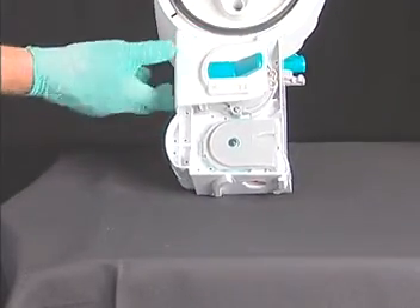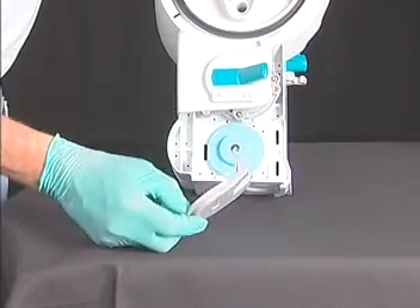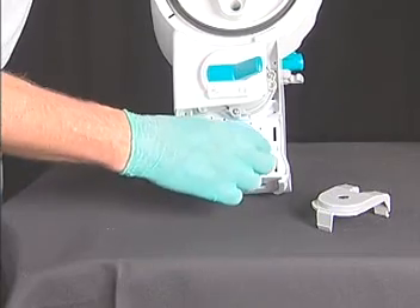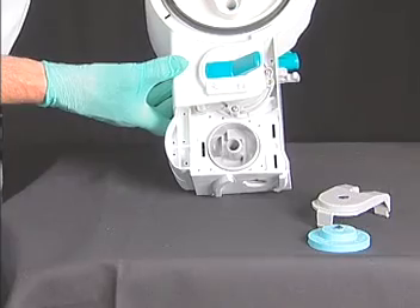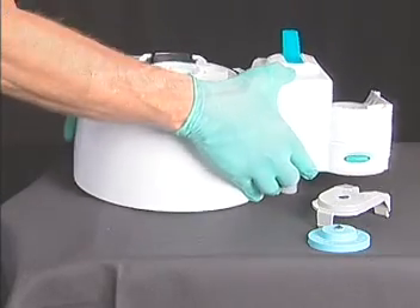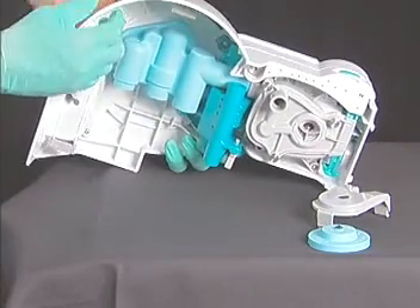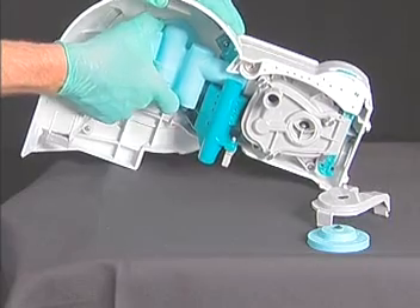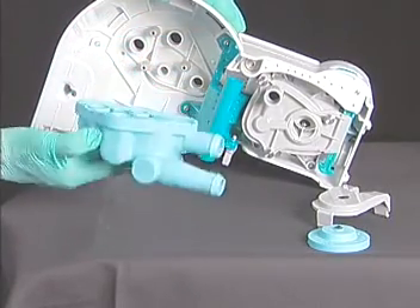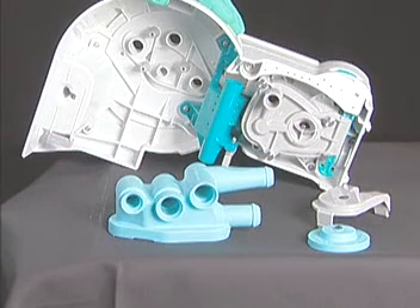The APL ramp can be removed by putting slight pressure on the tab connections as shown. Removal of this component provides additional access to the interior of the bellows base assembly. Turning the bellows base assembly upside down reveals the boot. This component is easily removed by grasping it and pulling it away from the bellows base. Disassembly to this level provides excellent cleaning access to all components of the ABS which come in contact with patient gases.